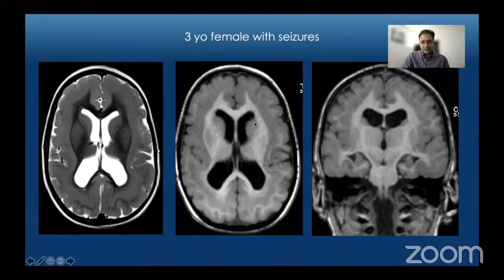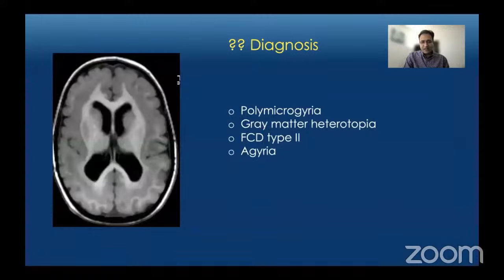The diagnosis is subcortical band heterotopia, not polymicrogyria, gray matter heterotopia, or focal cortical dysplasia type 2.